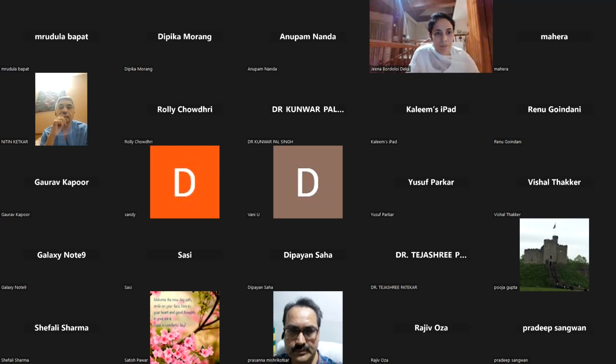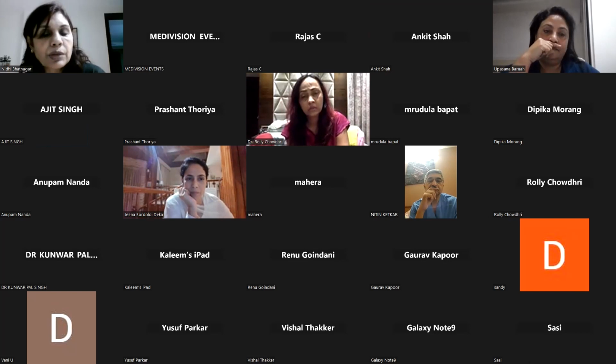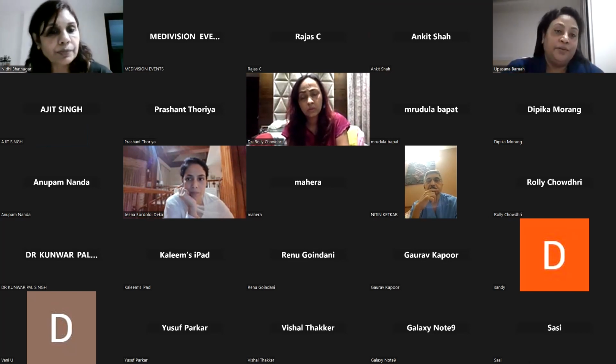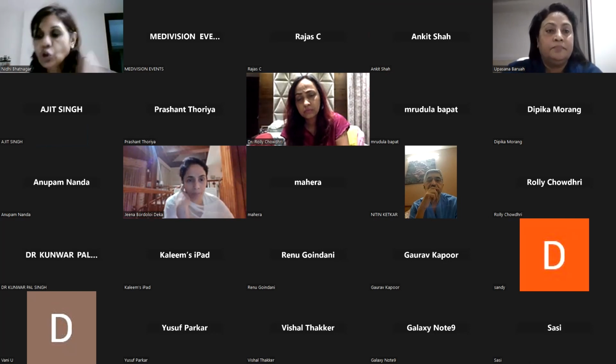And then of course you can keep adding the palmar bowing of the retinaculum, how much. We can keep adding on to our descriptors, but I think the CSA and the wrist to forearm ratio, is that what you call it, or do you call it just the CSA ratio? Upasana, the one that you said 2 millimeters? Wrist to forearm ratio, ma'am. So wrist to forearm ratio and an absolute CSA, I think, should be two parameters that should go, and then we could always do a dynamic scan.